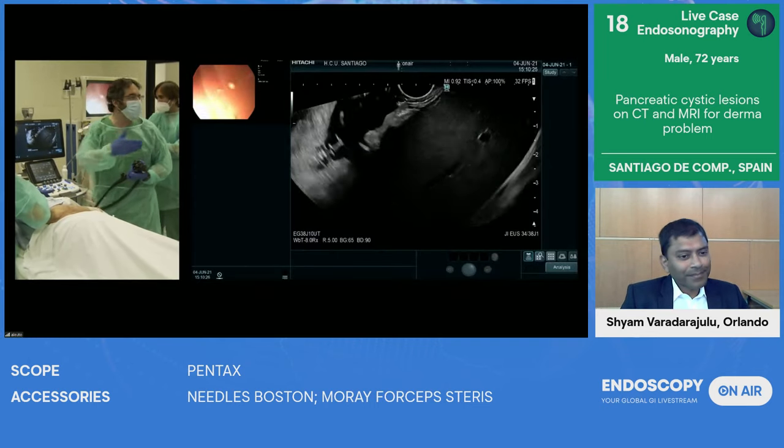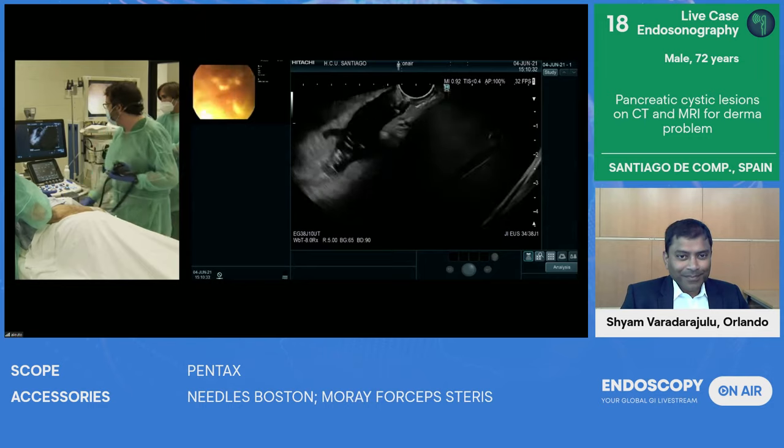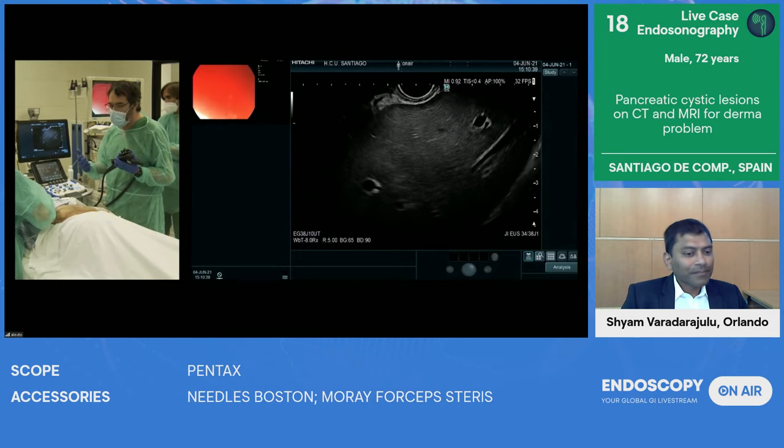Of course, any comment, we also have Danny and Julio, Danny and Jose with me. So please, Shyam, feel free to ask any question while we're doing the case. But okay, we are in the stomach. Now we are just taking a look at the liver, which is, of course, not the goal of the case. But I also want to show you something new.